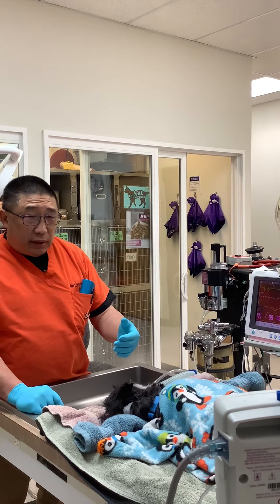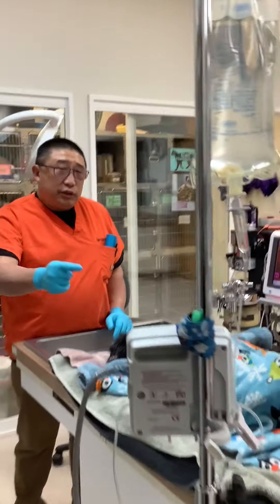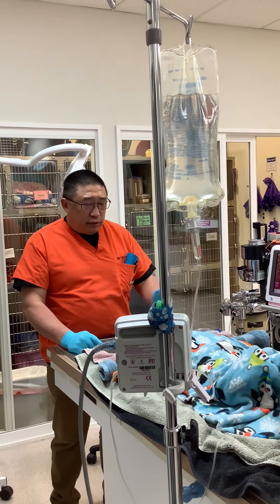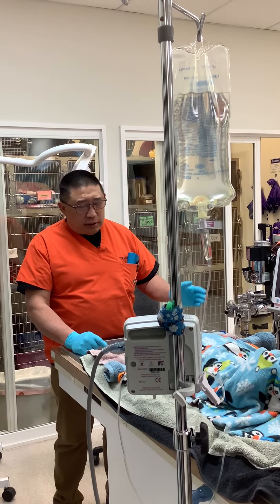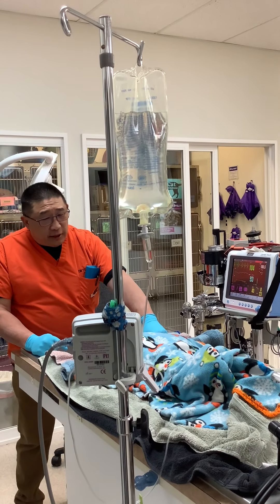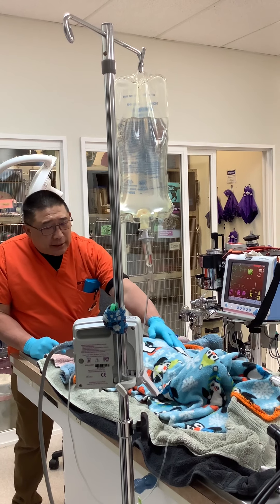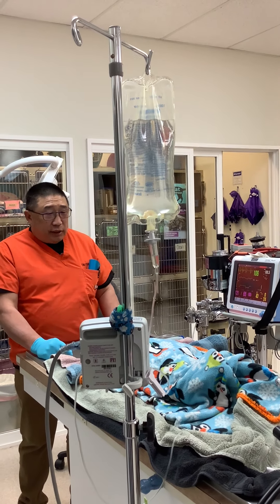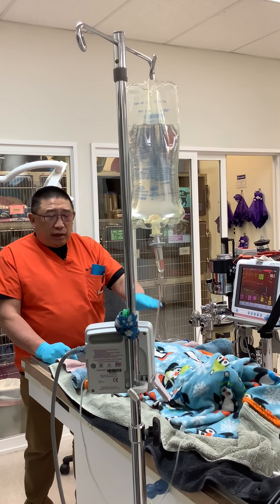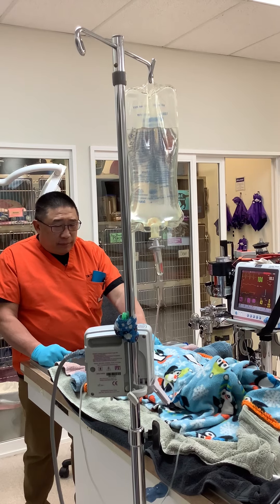During the course of this, patients are also receiving intravenous fluids through an IV catheter that goes into their little arm — everyone gets one who's under anesthesia. You can't see it underneath here, but our little friend is not only covered with blankets and cozy things, but underneath there's a water-jacketed heating pad that helps keep them warm. It's so nice on those cold days!